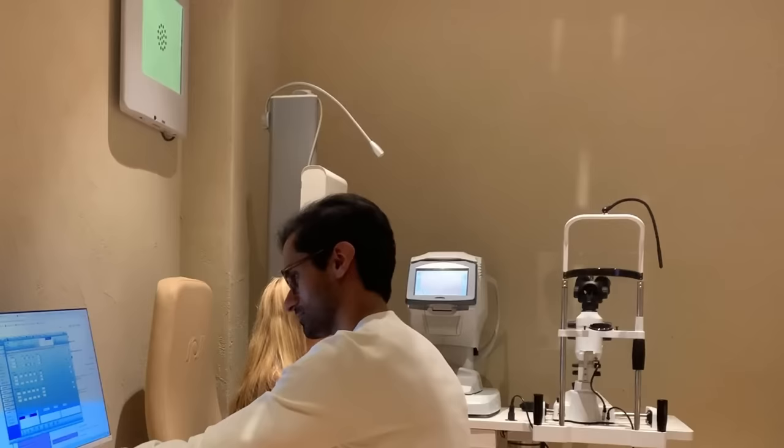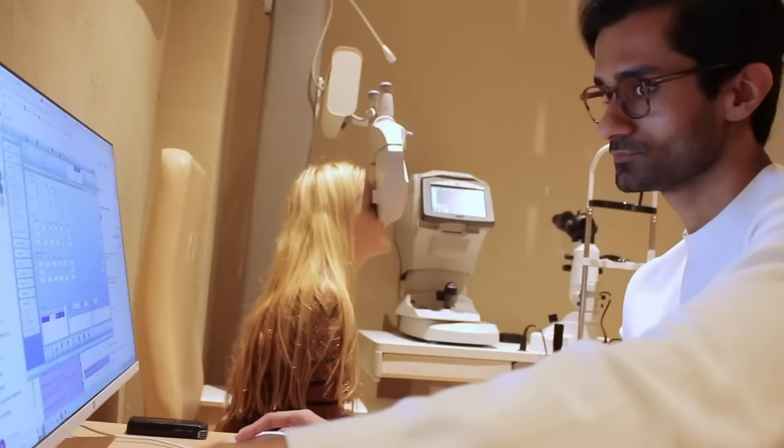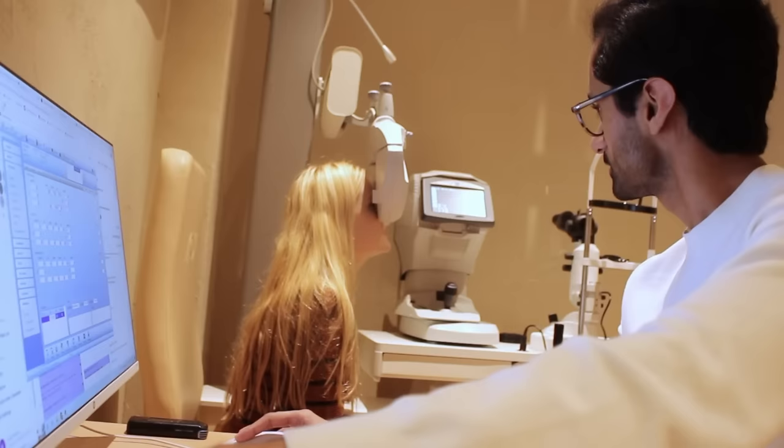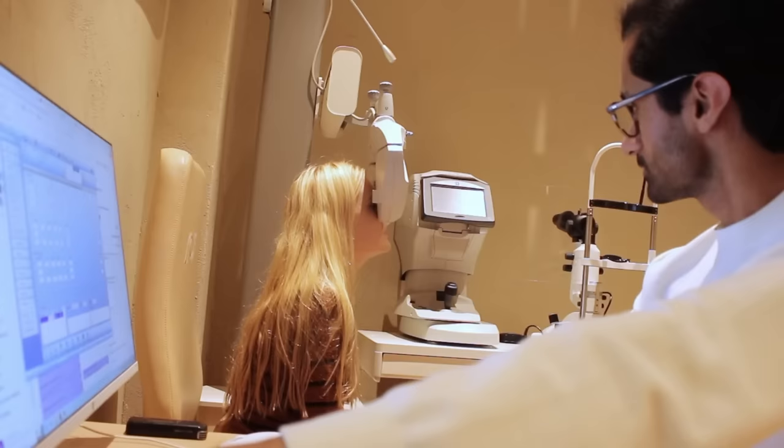I'm just going to finish on this. That's one. And that's two. Two is a lot better. Yeah. And three. And four. Or the same. Four is better. That's three. Yeah, four is better. Perfect. And then last time. One. Or two. That's one. And that's two. Say one.